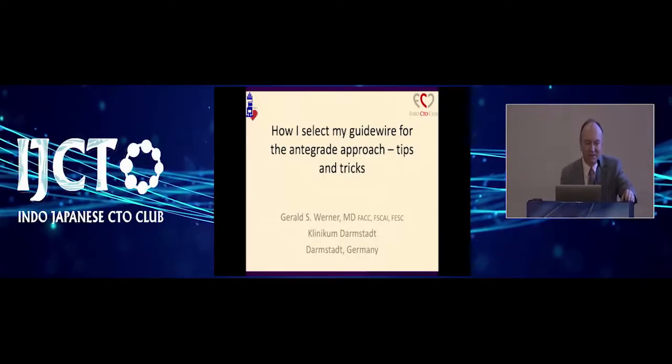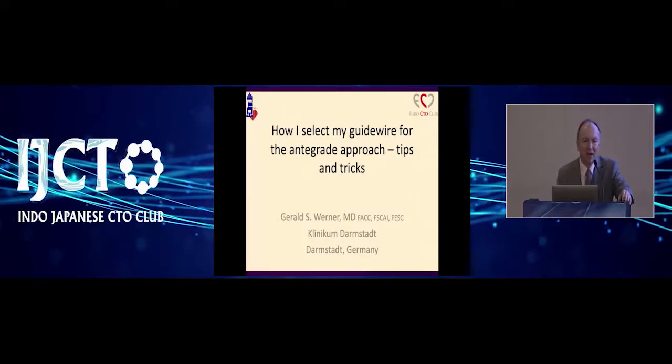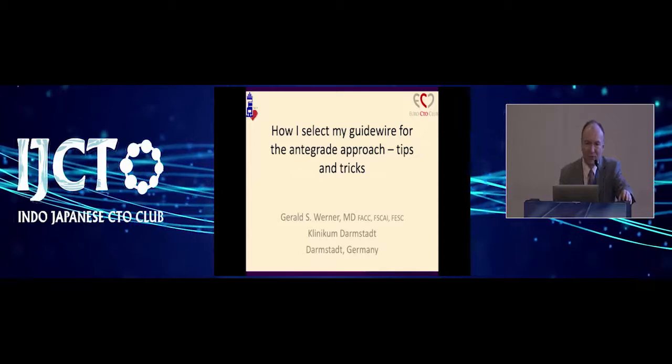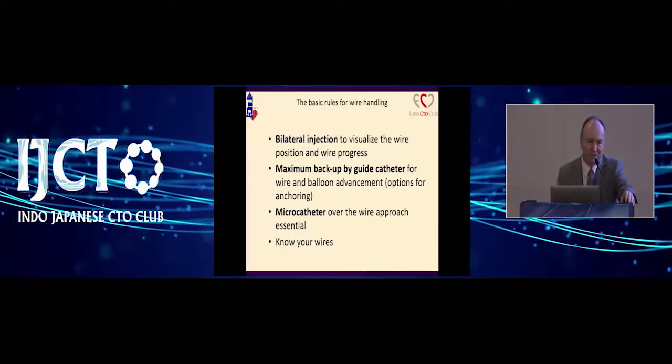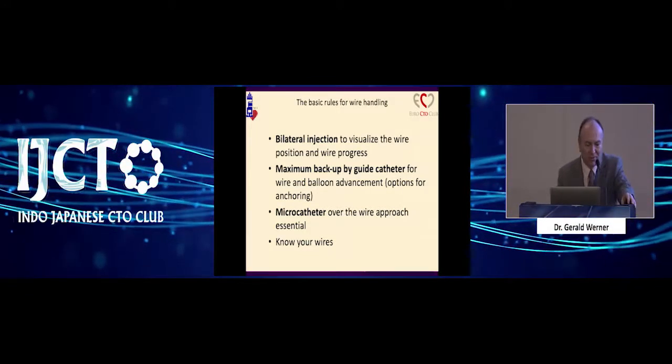Thank you very much. Well, the title is How I Select My Guide Wire, because it's certainly a very personal approach how to manage wire selection, and you heard in the first two live presentations different approaches. But there are some basic rules which I want to bring across.